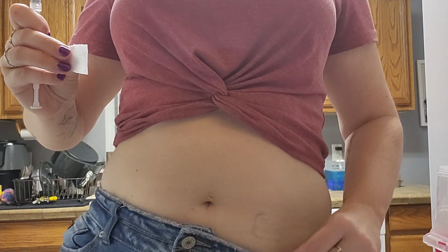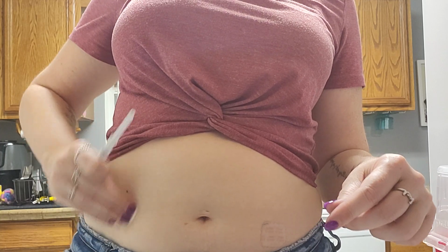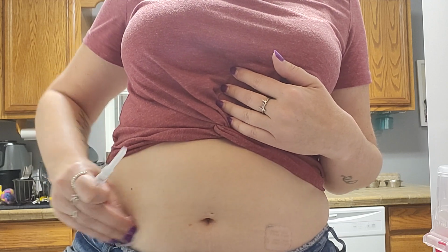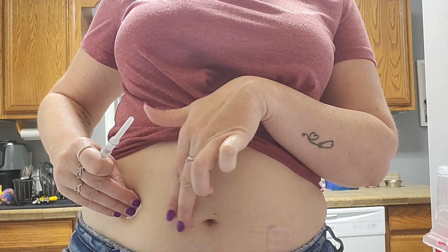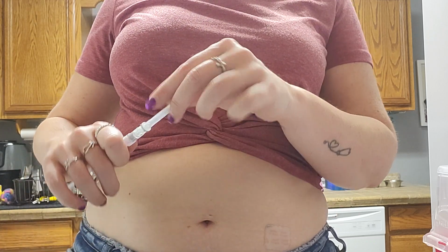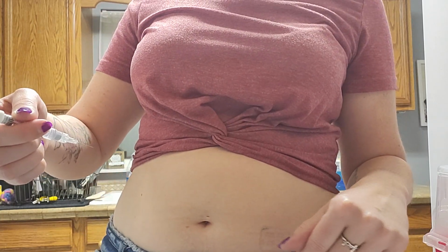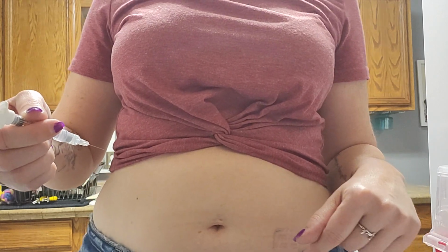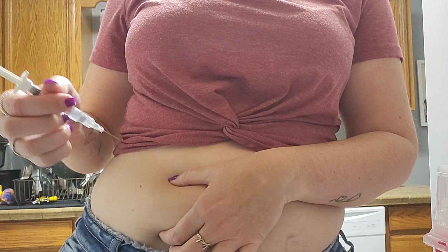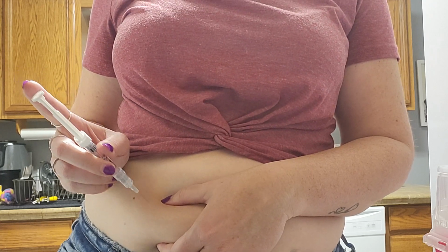So my patch is over here. So I'm just gonna come over here to this side and clean a nice large area, and then you always want to go 2 finger widths away from the belly button. Okay, let that dry, take your cap off. If you're a skinny person, you can go at a 45-degree angle, but if you've got some chunk like I do, you can go at a 90-degree, which I think is what I'm gonna do. So here we go, it's dry.